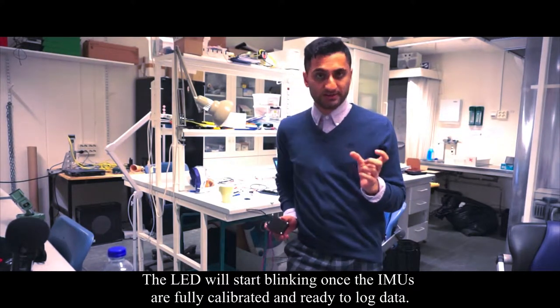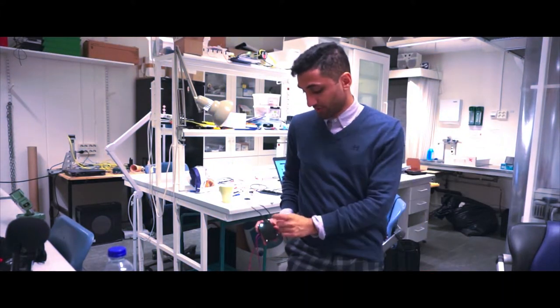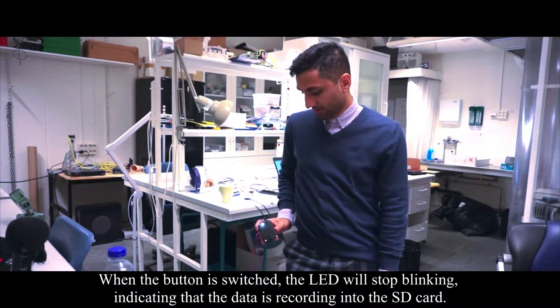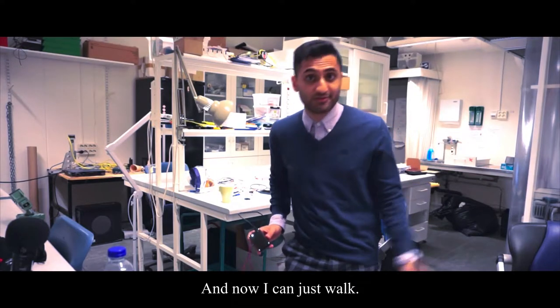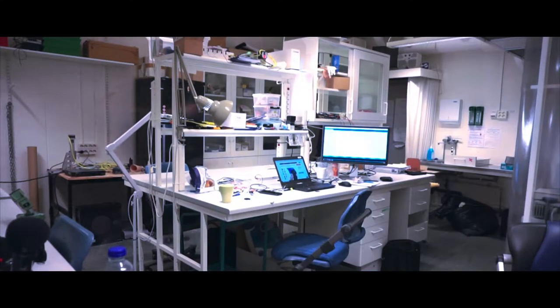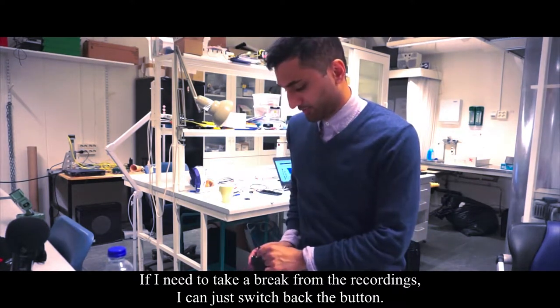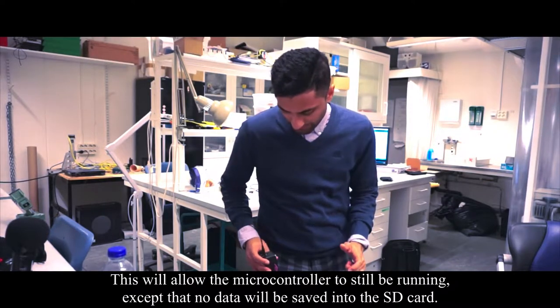I have a hinged wrap-around knee brace with two IMUs. Once the sensors are ready, the LED will start blinking, which means the sensors are calibrated and ready to run. When I switch the button on the right side, the LED will stop blinking and I can just walk.